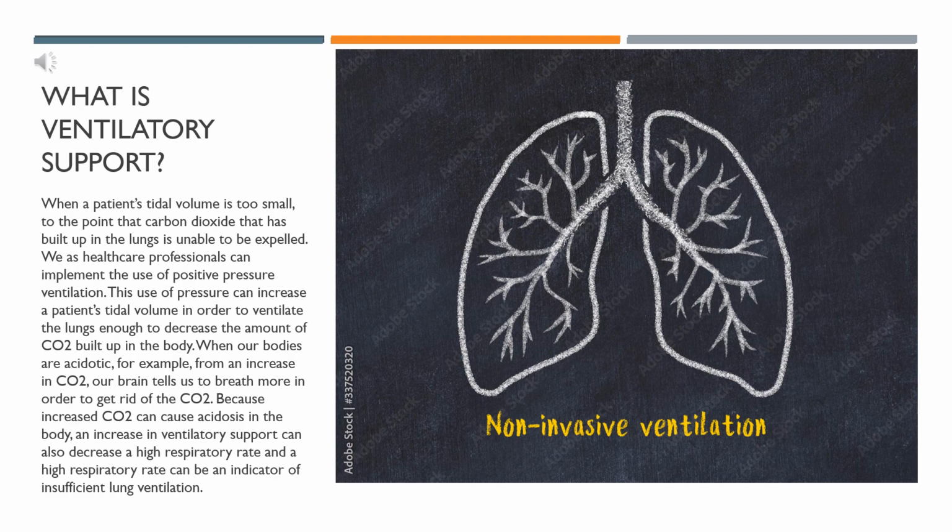We as healthcare professionals can implement the use of positive pressure ventilation. This use of pressure can increase a patient's tidal volume in order to ventilate the lungs enough to decrease the amount of CO2 built up in the body.